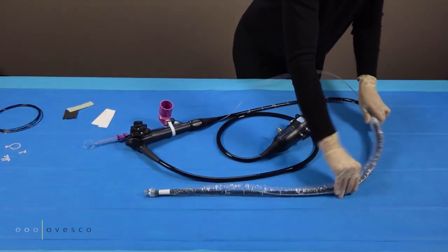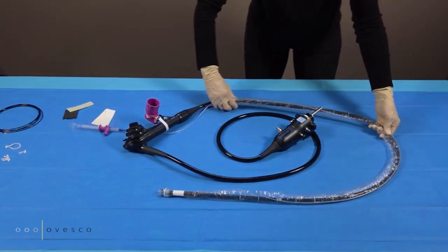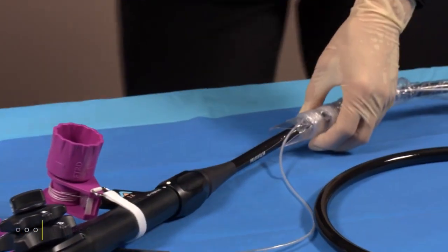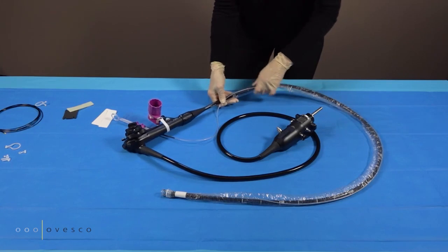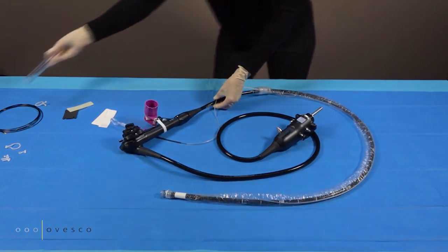Pull the sleeve to the endoscope — pull the sleeve to the end of the scope by holding the tube. Now remove the second plastic clamp. Remove the plastic tube from the endoscope by spreading it open.